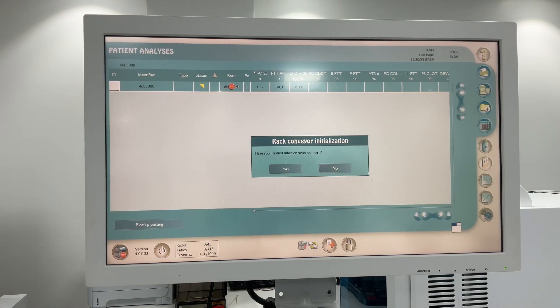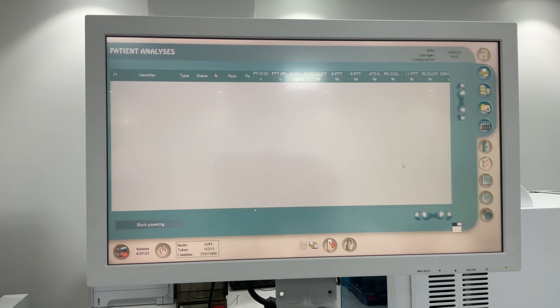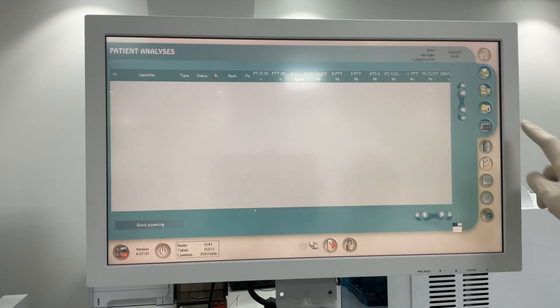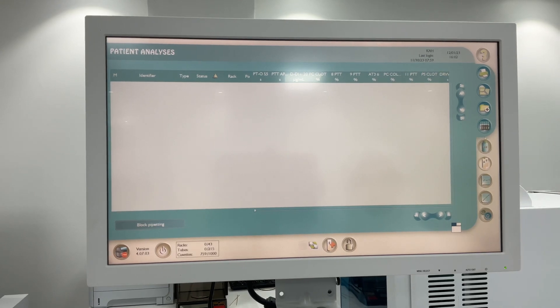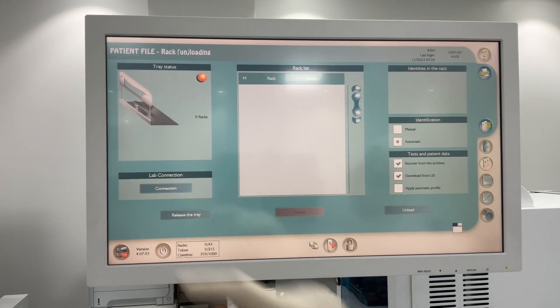If no rack, just click No. After returning, click here on this icon - the rack icon - and reconnect to the system by clicking Connect from here.